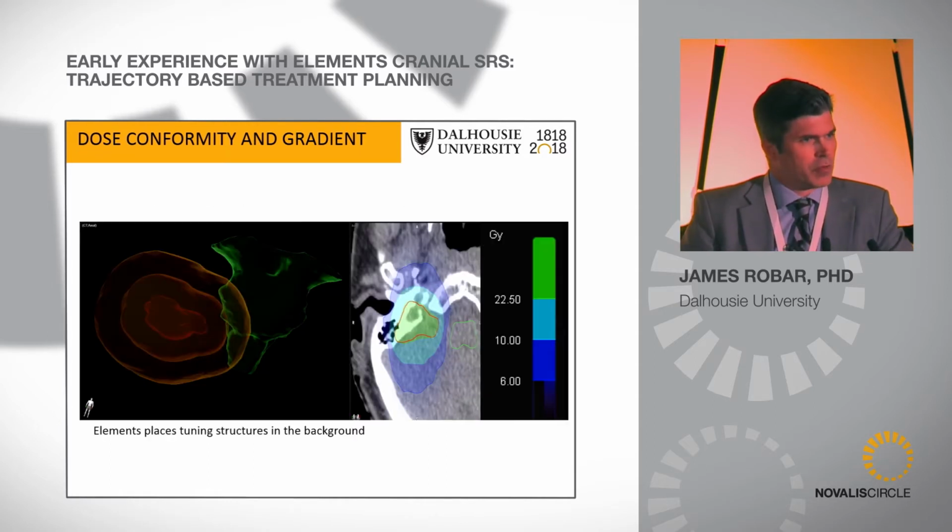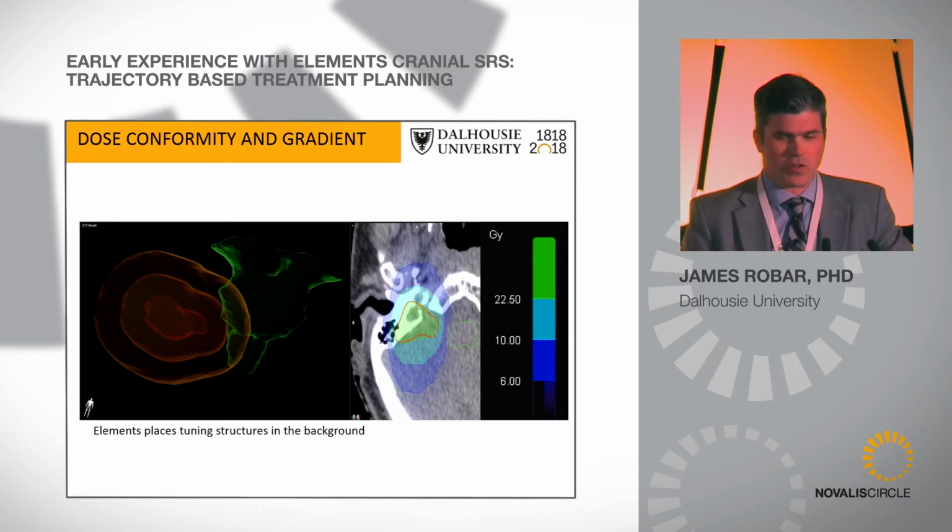I think the improved conformity can be explained quite simply, and Dr. Levin referred to this. Elements in the background is actually placing a couple of tuning structures around the PTV to try to ensure conformity in a very compact dose distribution.